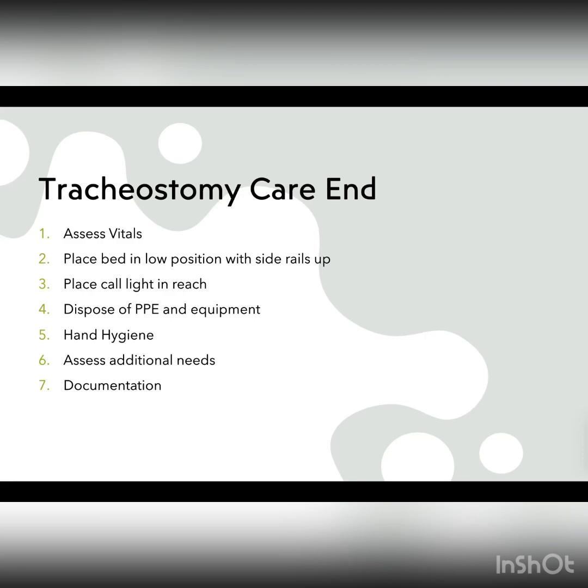We want to dispose of any PPE and used equipment in the proper storage bins or proper disposable containers according to agency policy. We want to perform hand hygiene, and we want to assess for additional needs of the client, and we also want to state the expected return of when we're going to be back in with the client.